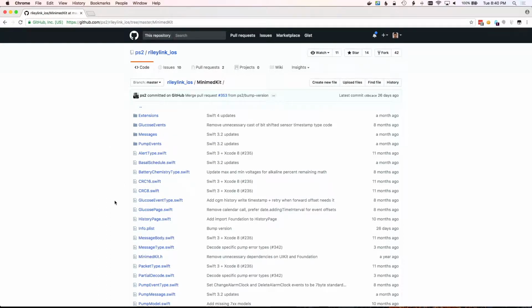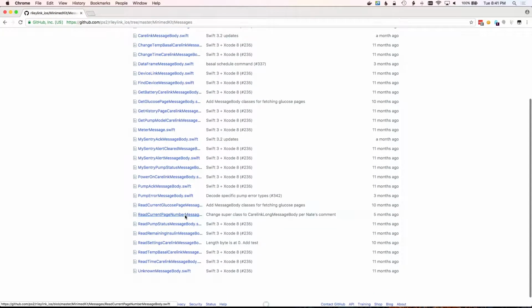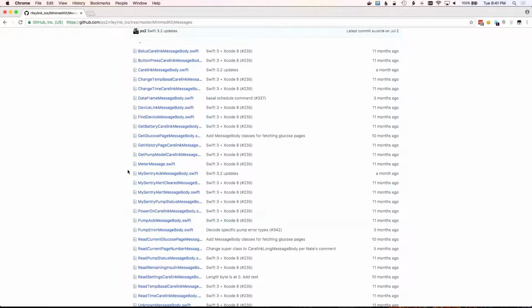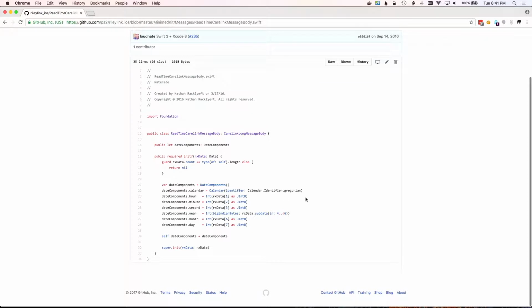But the different kinds of commands that you can send to the pump, I mean, there's a lot, way more than 4. You can kind of see there's quite a few here. And what I'm really looking for is to find out how to get the current date and time. It looks like there's one called read time, so I'm going to look at this one first.